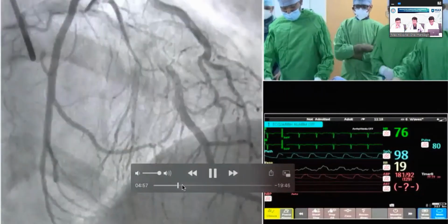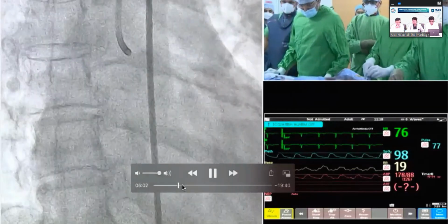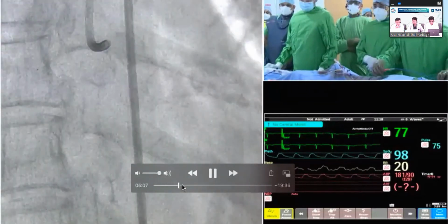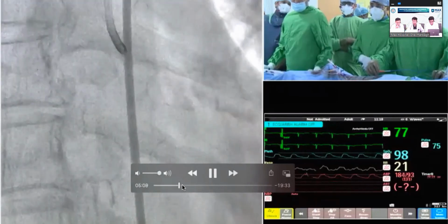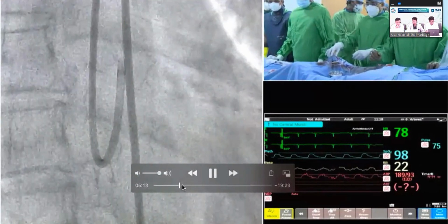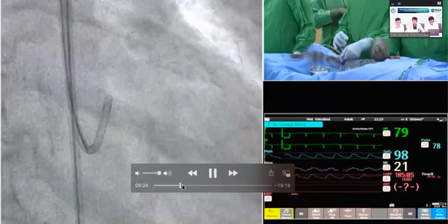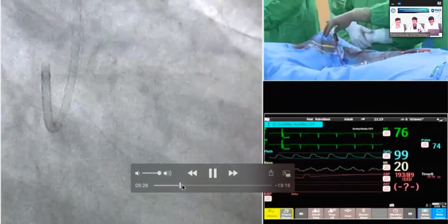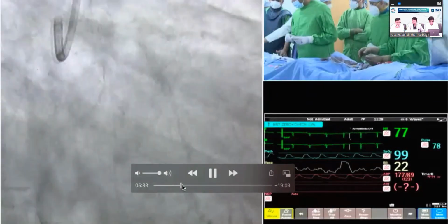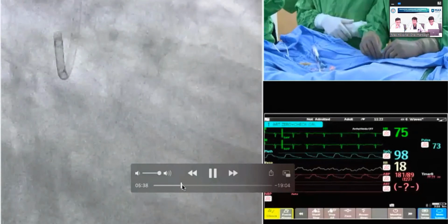So you can see the coronary angiogram in the caudal view and the PA cranial view. We are using a 7 French guiding catheter through the femoral route. This is an EBU guiding catheter. We need extra support, that's why we use this. Wire, please. So, this is a check angiogram. Soft PT wire, followed by microcatheter. Yes, yes. 8000 heparin given. Workhorse BMW choice PT wire, and we are using the Finecross catheter.